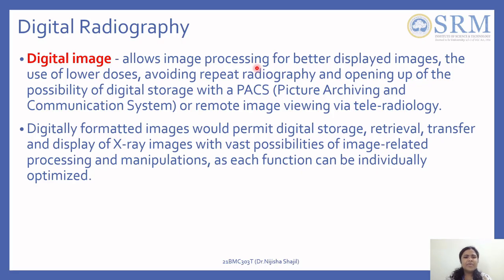So you can even store it in a digital way. You can transfer it. So you can go for remote image viewing, teleradiology, all can be done. So these digitally formatted images permit digital storage, retrieval, transfer, display. Everything is possible with the help of digital radiography.